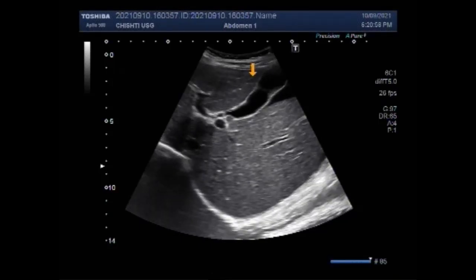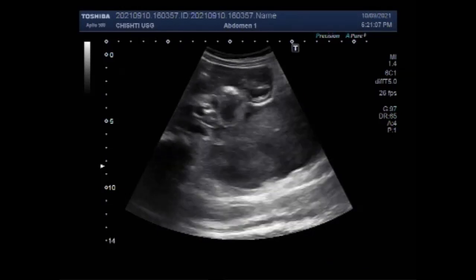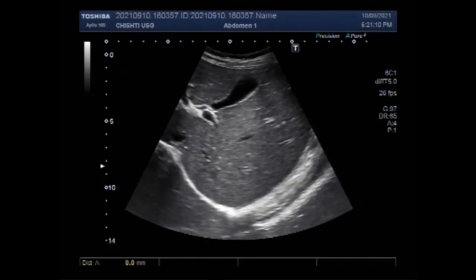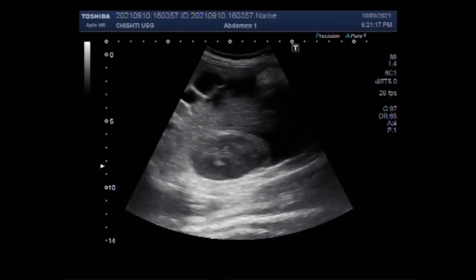Dear viewers, I hope you are all fine. This video shows a case of hemoperitoneum with intestinal obstruction. You can see the liver, gallbladder, and fluid seen along the hilum of the liver.